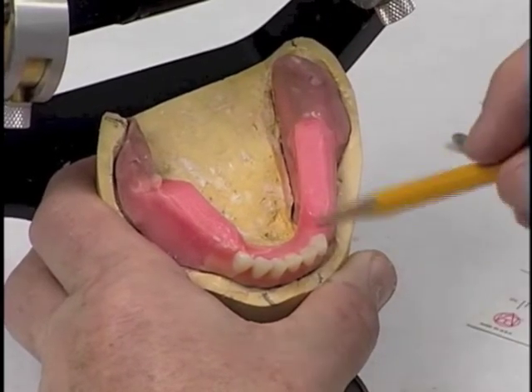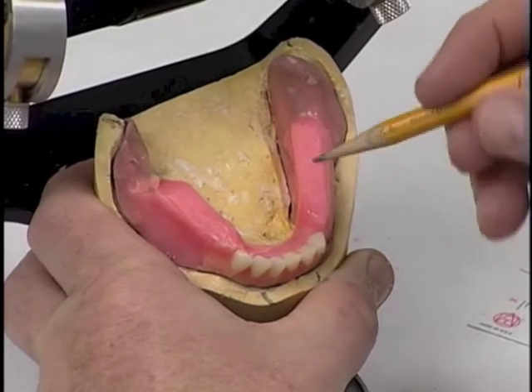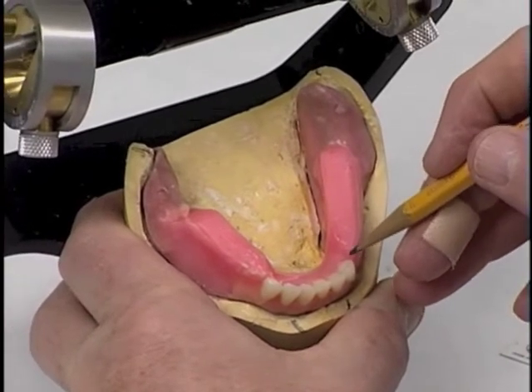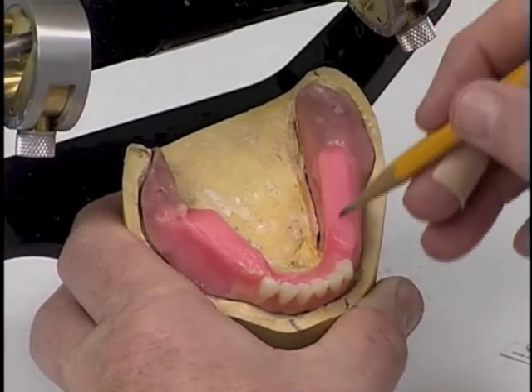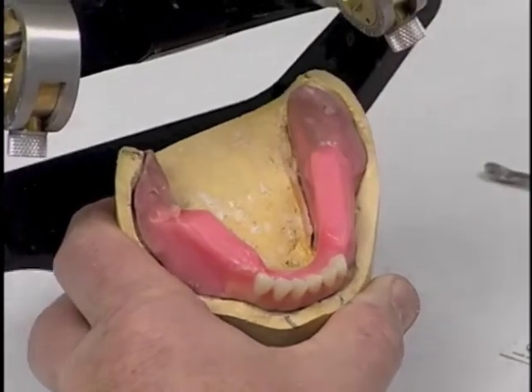So in placing our teeth, the object is to get those teeth placed in such a way that the central groove of the posterior teeth is going to be directly over the crest of the ridge. And that's what we're looking for on both sides.